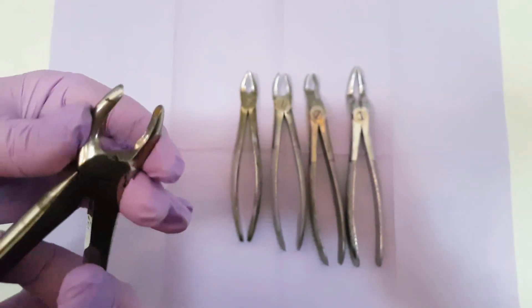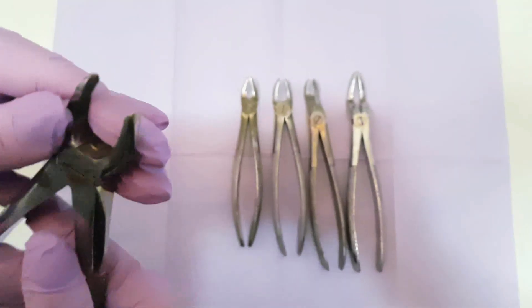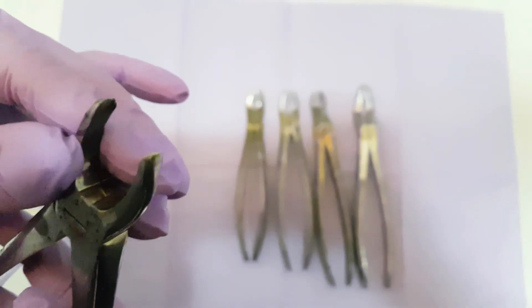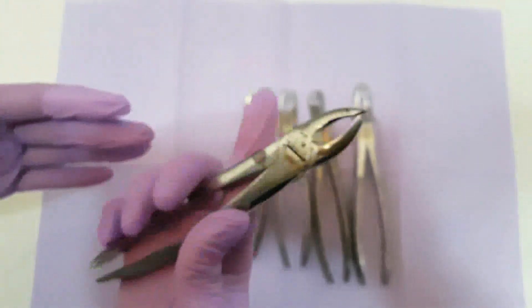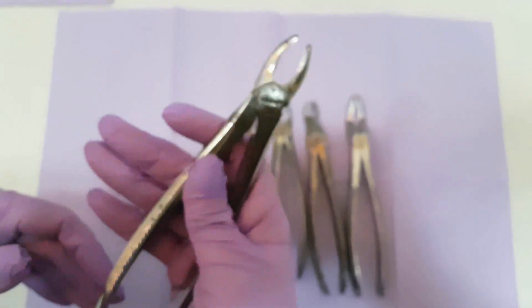The working beaks are straight because of the form and position of the frontal teeth. You can see also the inner part of the working beaks. This is how we properly hold the upper frontal forcep.